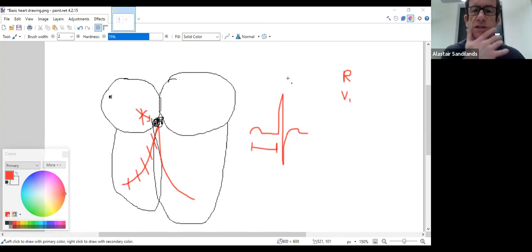If the P wave comes after the QRS complex in a junctional rhythm, would it be difficult to differentiate it from a T wave? Yes, it might be. It might be difficult, but in actual fact, the algorithm allows for you not seeing a P wave. When I come to the algorithm, if you don't see a P wave, but you have a flat baseline, you should think of a junctional rhythm. But sometimes, if you look hard enough, you might actually see a P wave. I will show you some examples later on.